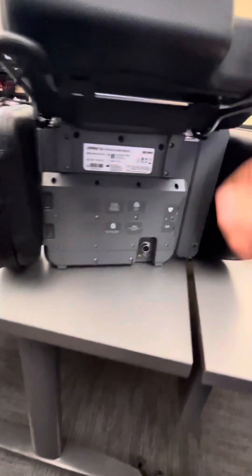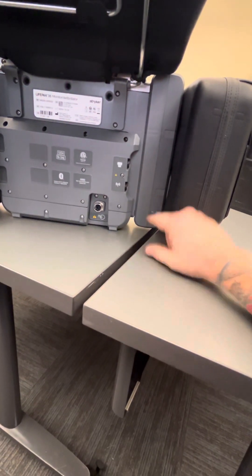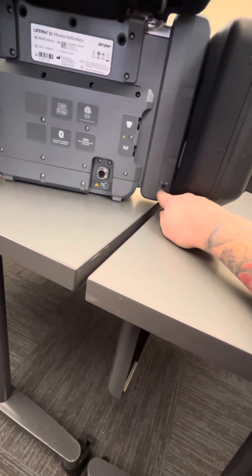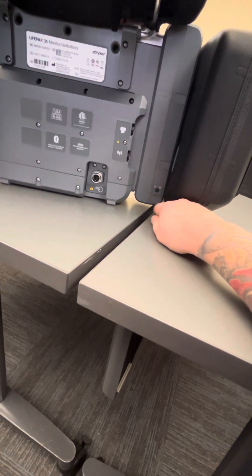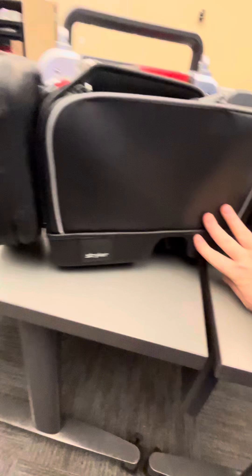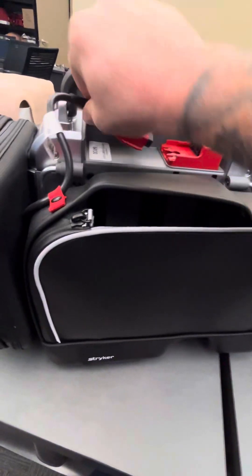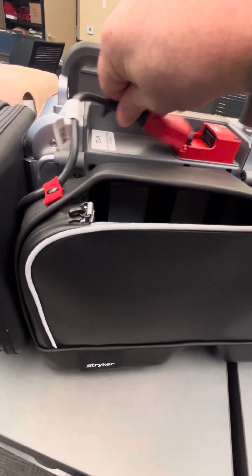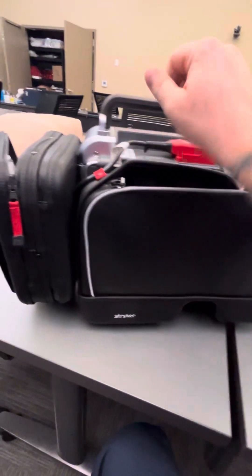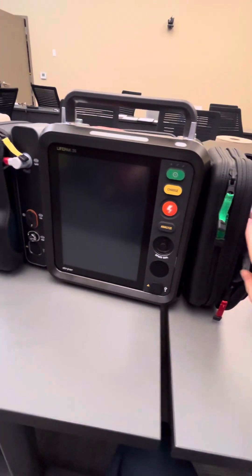Another important feature on the back: this is where your AC power cord connects. Your end-tidal CO2 connects to the front, but this is the exhalation port. Should you ever get an error on your end-tidal, check back here and make sure the exhalation port is not covered. Your defibrillation cable plugs into the top, very similar to the LifePak 15 — and that is the outside of the LifePak 35.